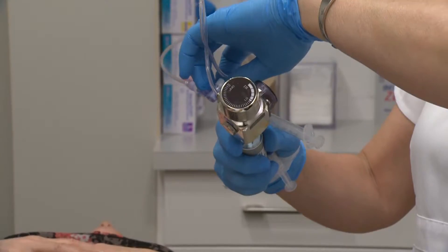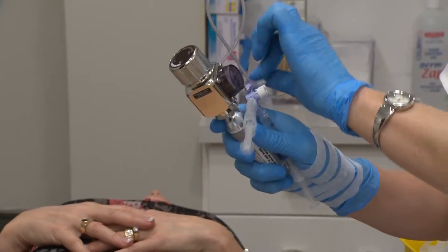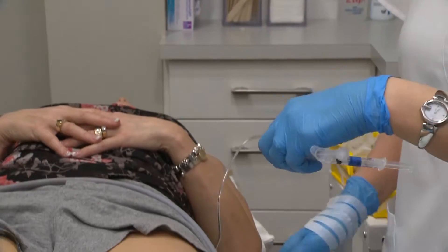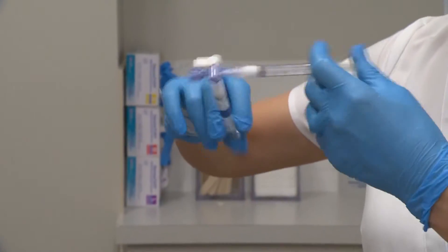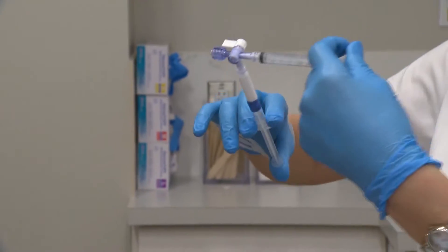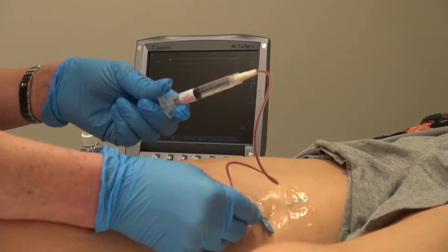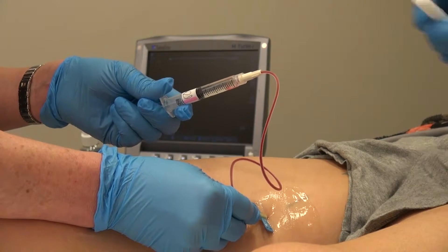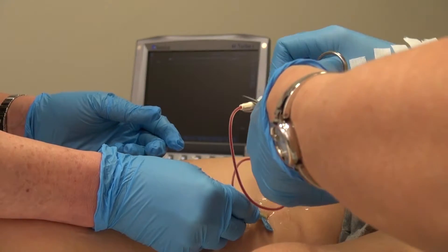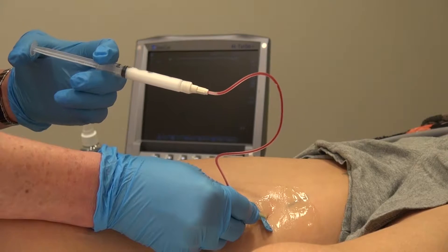The nurse mixes the sclerosant medication with CO2 gas to produce a foam. The use of foam sclerosants over the last 15 years has resulted in a much higher success rate at closing large varicose veins compared to using liquid sclerosants. Dark blood is not pulsating, so we know we are not in the artery.